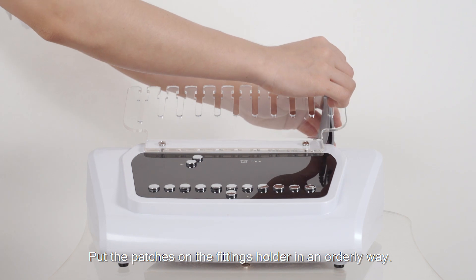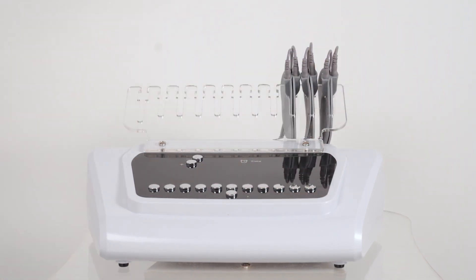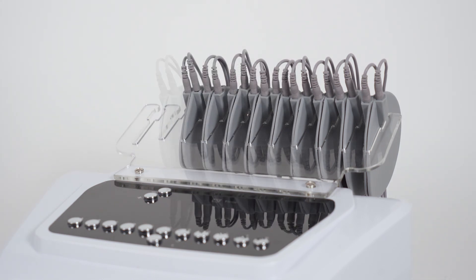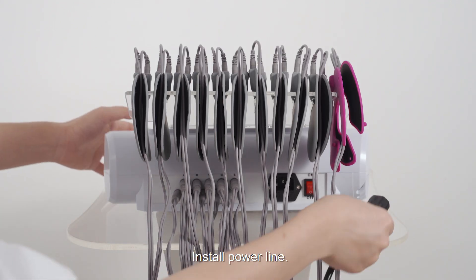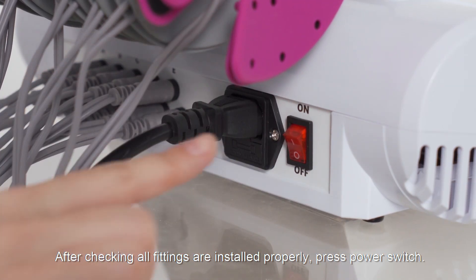Put the patches on the fittings holder in an orderly way. Install the power line. After checking that all fittings are installed properly, press the power switch.